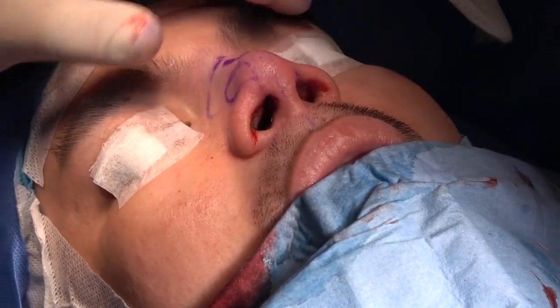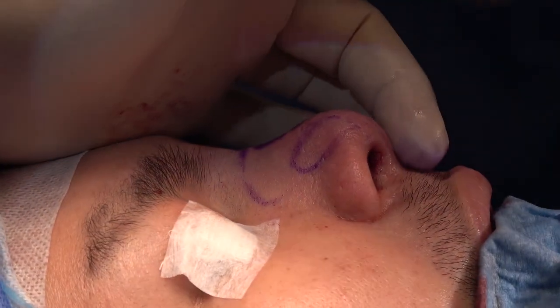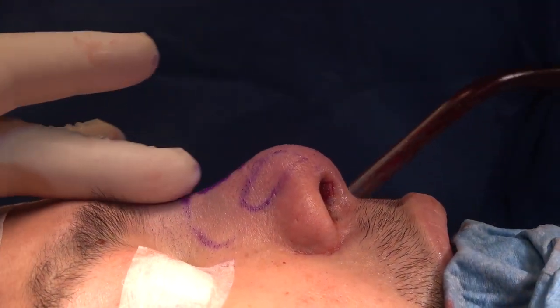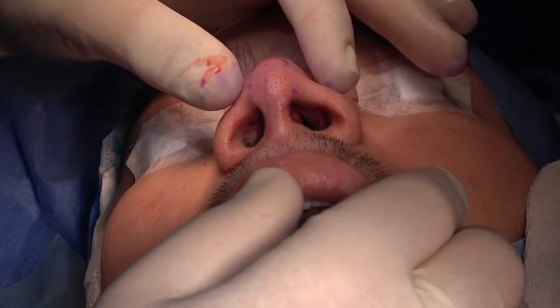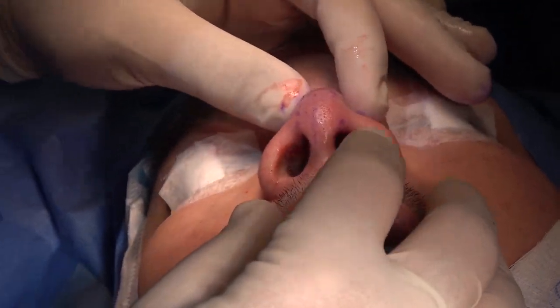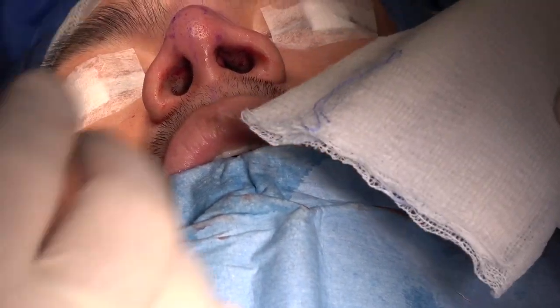Now, in a gradual section, maybe the last step of the procedure, you got nice tip projection, nice tip elevation, nice high dorsum. Okay. And now we do the alar wedge resection.